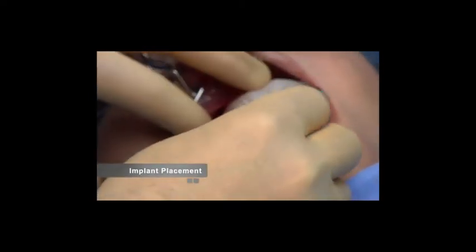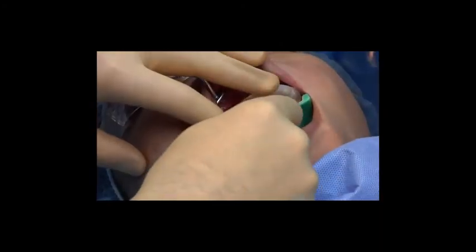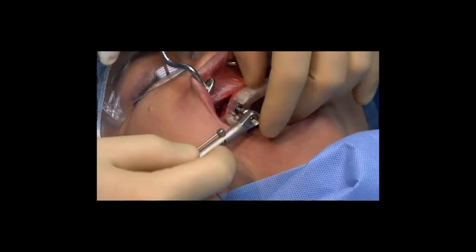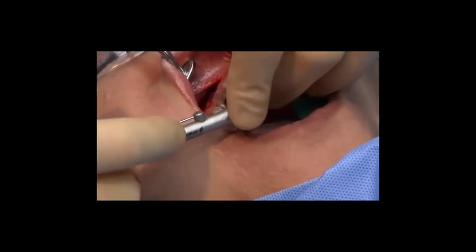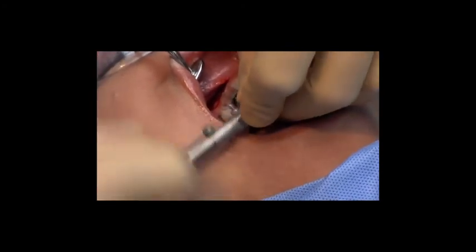But before we do any type of grafting, obviously we place the implant now through the guide, fully guided. The flap reflection apically is done before the implant placement so that we don't have to scrape the flap off of the implant surface with our periosteal, so that the flap is reflected apically there, and then we place the implant so that nothing really but blood touches the implant surface. So here's the fully guided implant placement.